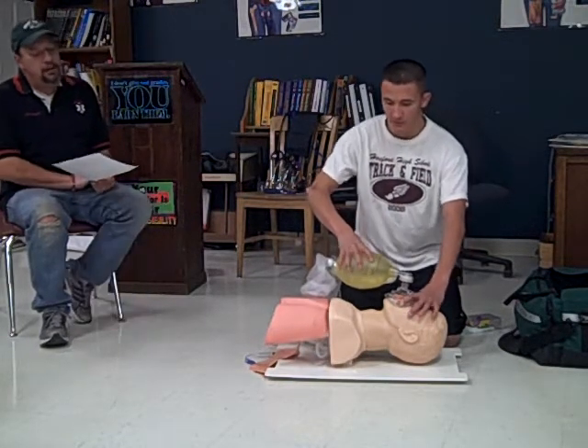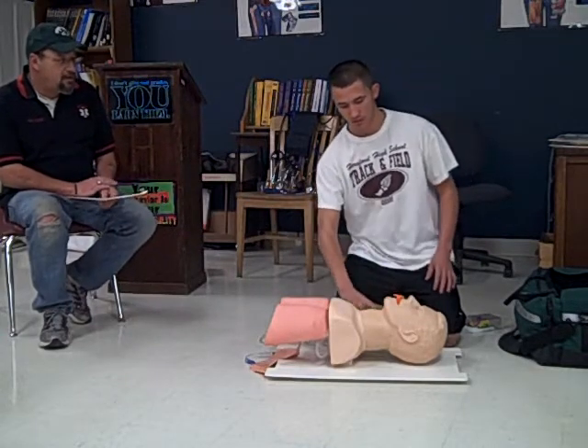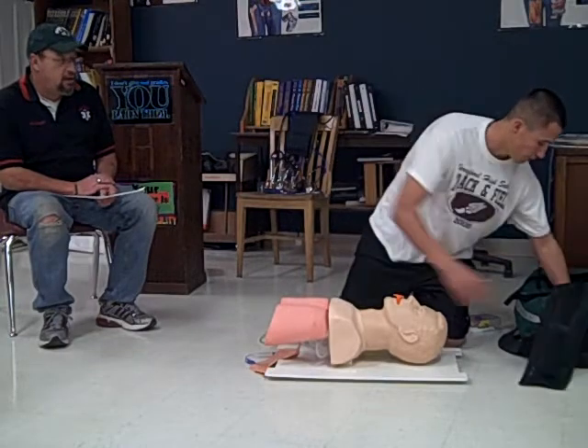I am now witnessing you ventilating the patient for approximately 30 seconds. You are now instructed to connect the patient to a high-concentration of oxygen and continue ventilations.